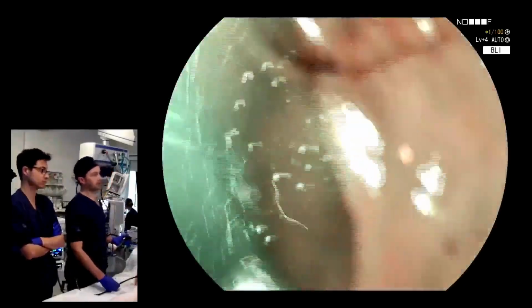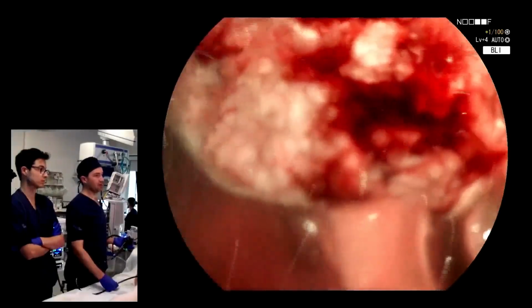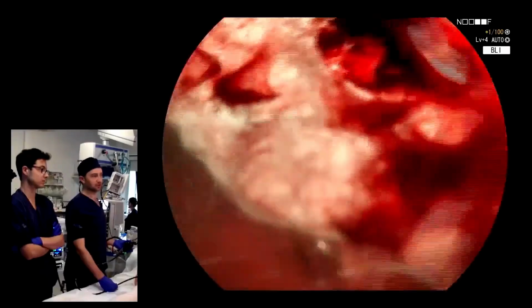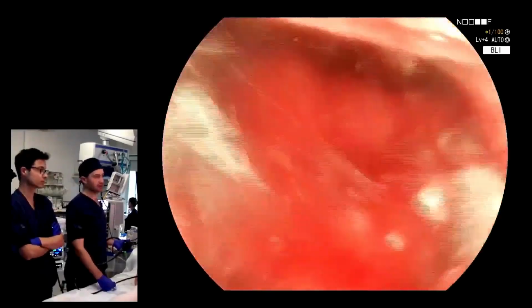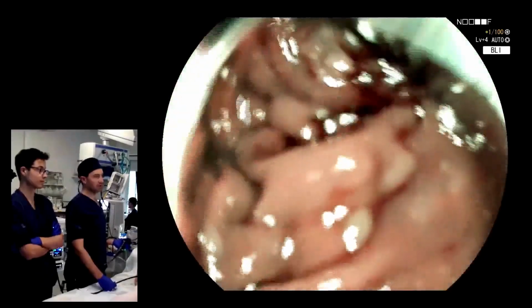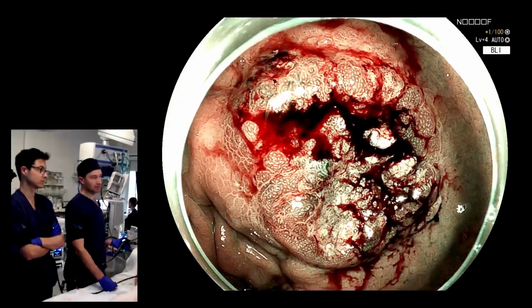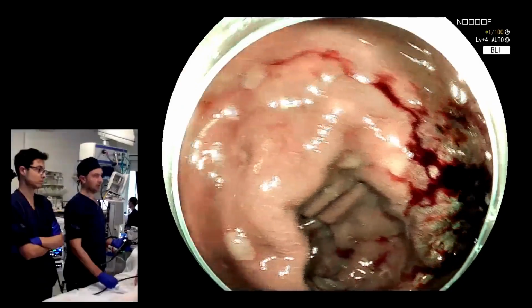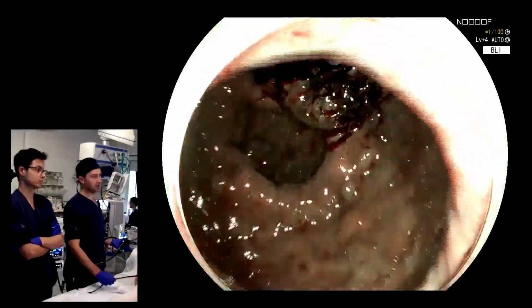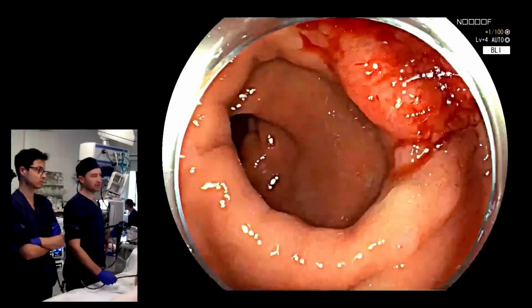Anyway, when we back off it now, and we haven't used any kind of water immersion or anything, you get this kind of image. I think this is a lot of the time why people struggle. They have this, and then they think, well, actually, I sucked onto it a bit maybe. So the technique to avoid that is turn the magnification off. Okay, we get some idea, right? But it was better before, because before we had no blood on it. And use water. And you have to have a cap, because if you don't have a cap, then you are in trouble.